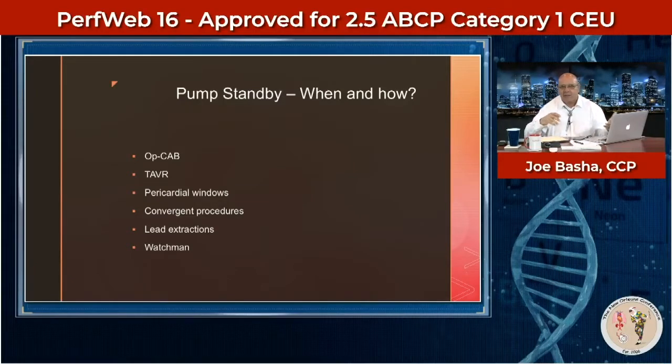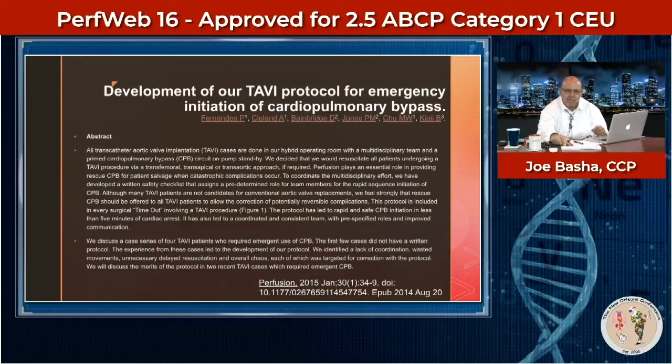And I think there's huge variation across the board with how we are all doing this. I want to illustrate some of that with some of these next slides. I need to look at my computer at the same time because the text is rather small. But let's read this, this is very interesting. Development of our TAVR, they call it TAVI. And just so you know, TAVI and TAVR are the exact same thing.